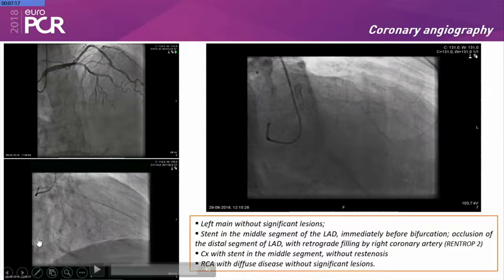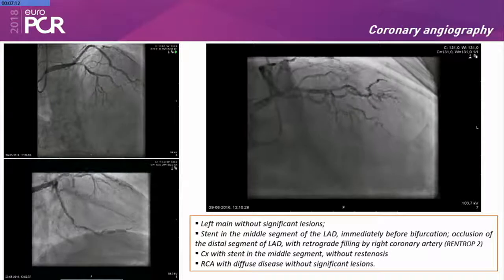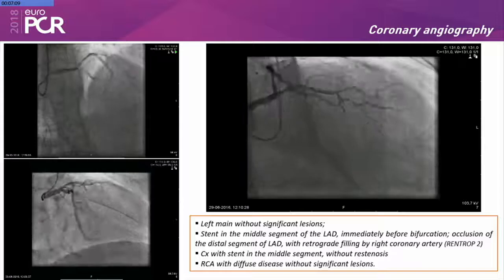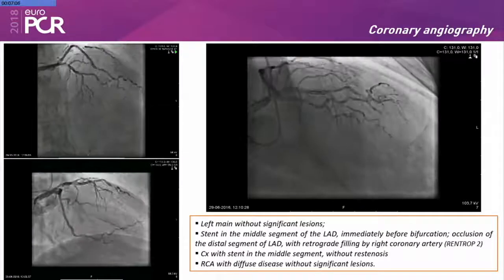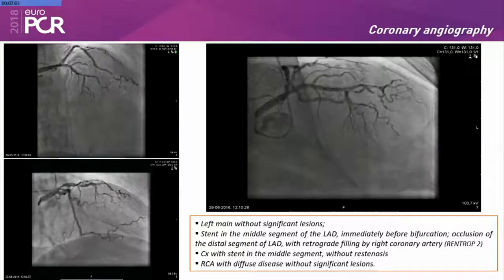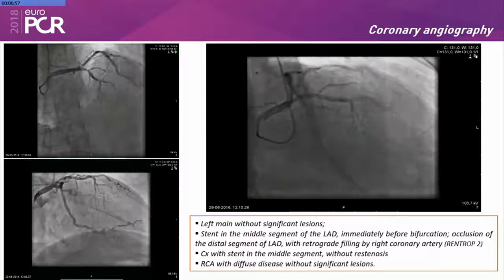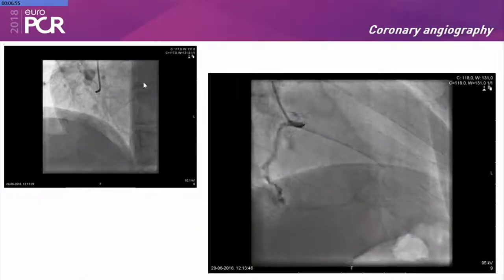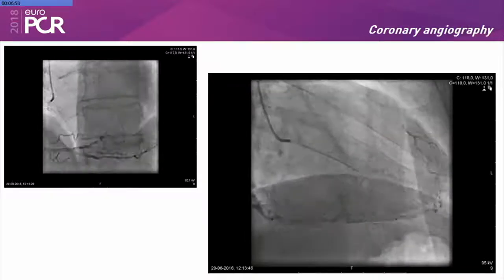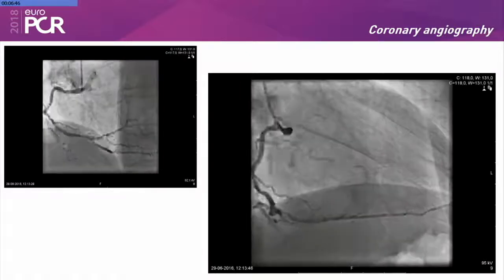The coronary angiography showed a left main without significant lesions, a stent in the middle segment of the LAD, and an occlusion of the distal segment of the LAD, and as we can see in the next slide, retrograde filling by the right coronary artery. The circumflex was assessed in the middle segment without restenosis, and the right coronary artery showed no significant lesions, with retrograde filling of the left anterior descending artery — RENTROP 2.